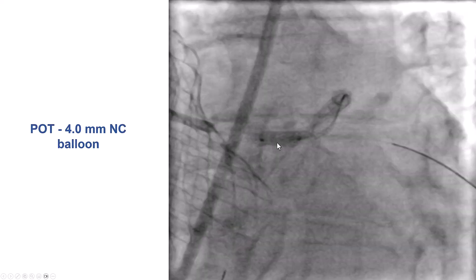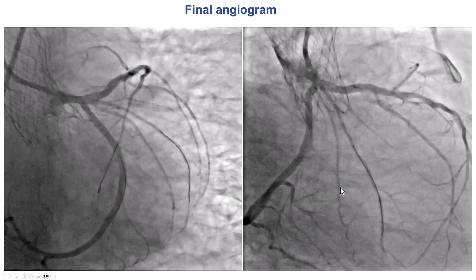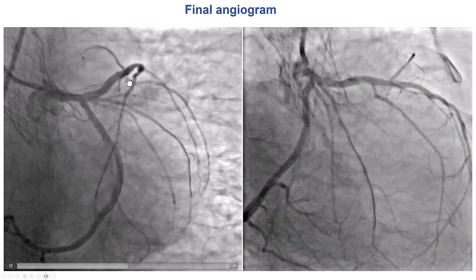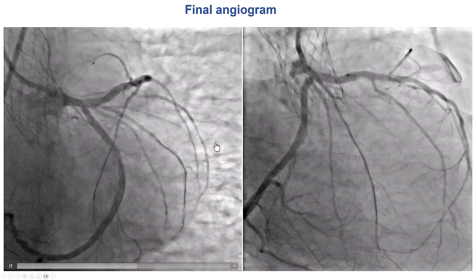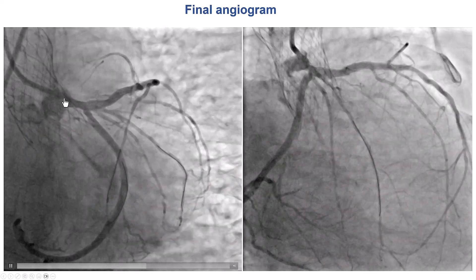We performed proximal optimization with a 4.0 mm balloon, and the minimum lumen area improved from 5.8 mm² to 6.8 mm². It's still not perfect and still oval with residual calcification, but the area is acceptable. This is the final angiogram: we have good flow into the LAD, good flow in the circumflex, as well as the two Ramus branches. The left main is well expanded.